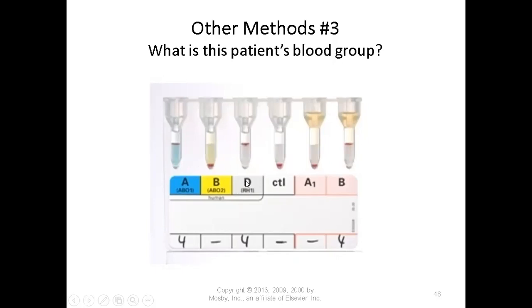When we look here with the anti-D, we could see once again a 4+ reaction of the patient's cells on top. So this means that the patient has the D antigen that reacted with the anti-D in the tube. And so basically, what I like to do in the beginning is just look at the forward typing and say, okay, well, what type does my patient look like based only on the forward typing? And this, we're going to say A positive, okay? A and D. So remember, D is the one that tells us about the RH.